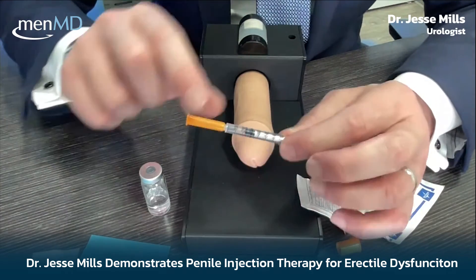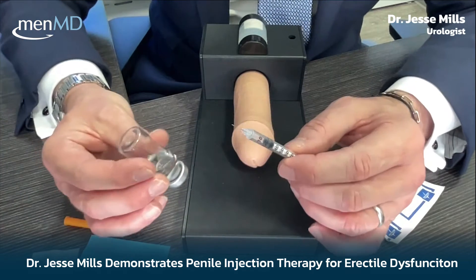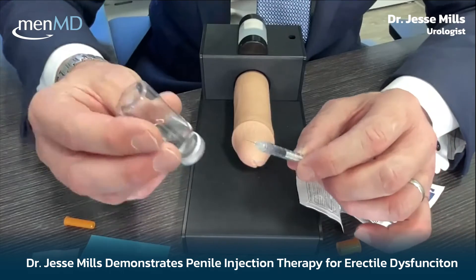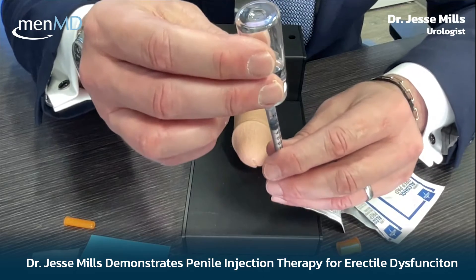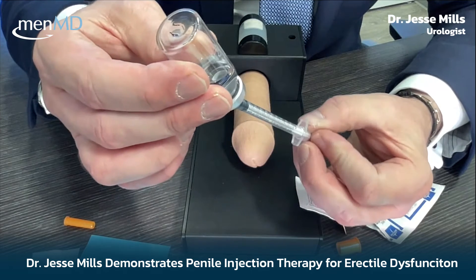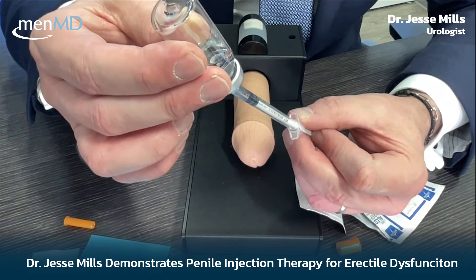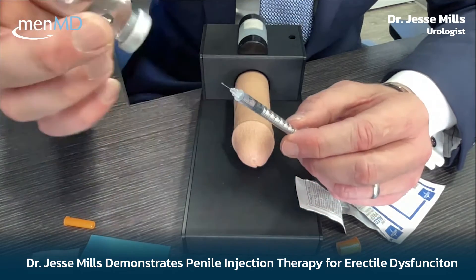Wipe the gray rubber top of the vial — it's a silicone/latex top, very squishy — and that's where you'll insert the needle. With your alcohol swab applied and the syringe pre-drawn to 25 units, flip the vial over so you don't pull in air. Inject air into the vial, then slowly pull the plunger back to draw the medication until you're back at 25 units. Make sure it's fully filled — the fluid is clear, but once you've confirmed you're at 25 units, you're done.